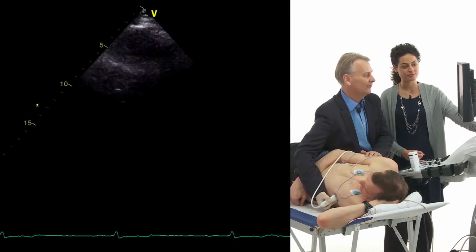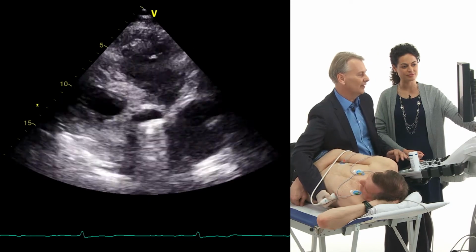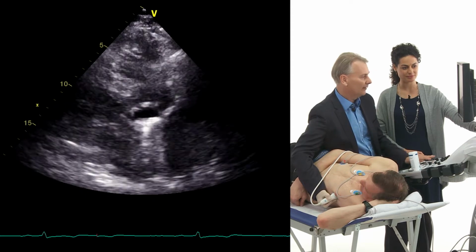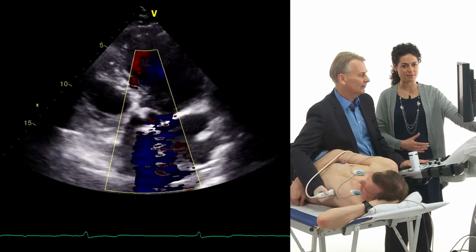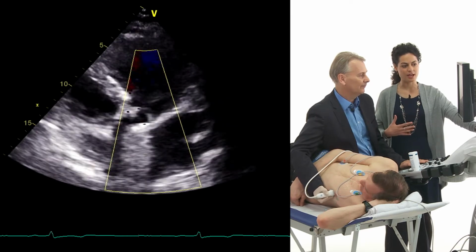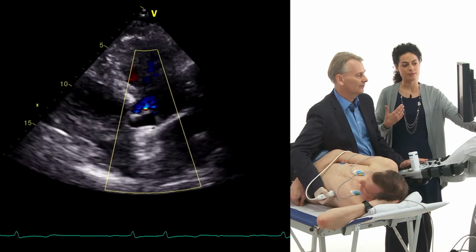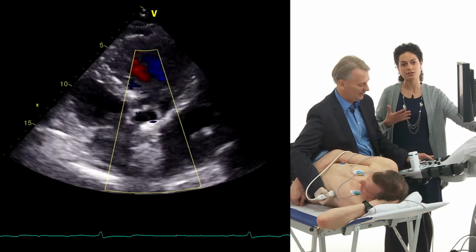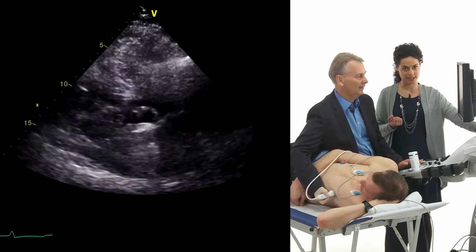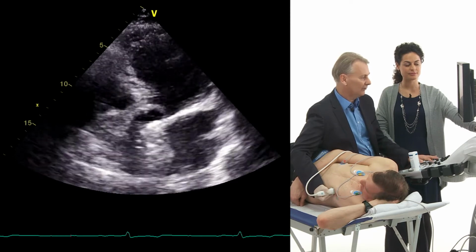Right. So to look at regurgitation, I would do a number of things. The first, I would perform, again, the 5-chamber view and look for a regurgitant jet. So remember, this patient underwent a Bentall procedure. So actually, we are looking for valvular regurgitation, because in a Bentall procedure, actually, we cannot have paravalvular leak. Yeah, so this is just for demo purposes. We cannot expect to have paravalvular leakage.